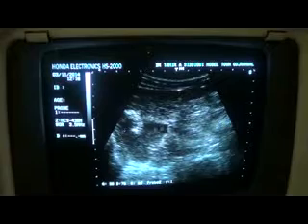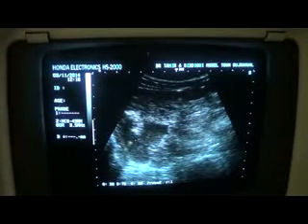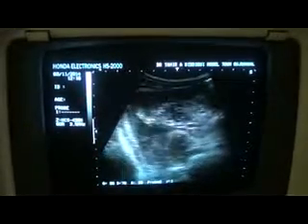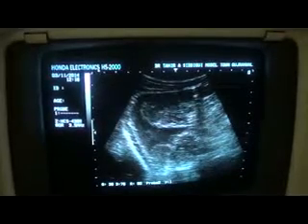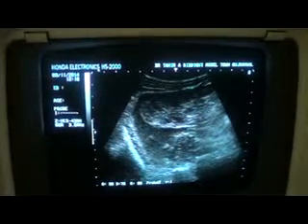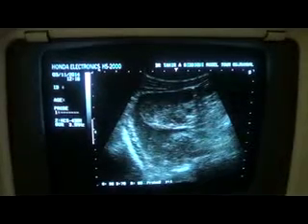This is a fluid pocket with echoes. We also saw ascitic fluid in the left lumbar location and around the spleen.